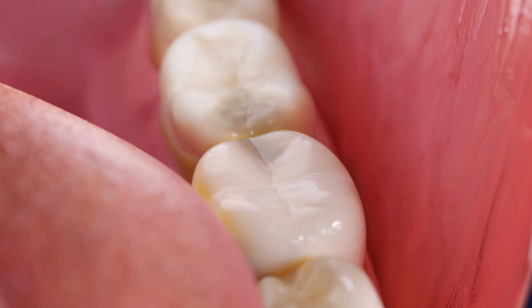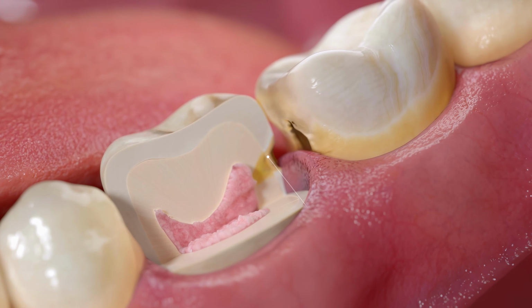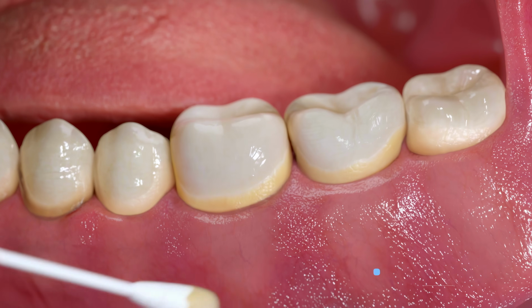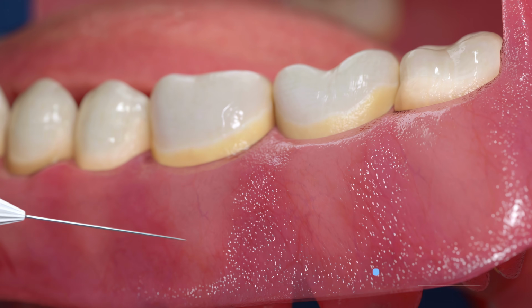Interproximal caries is a very common and insidious pathology in dentistry. Neglect of interdental hygiene and the persistent presence of dental plaque between the teeth may lead to carious lesions on their proximal surfaces, often remaining unnoticed during routine examination.